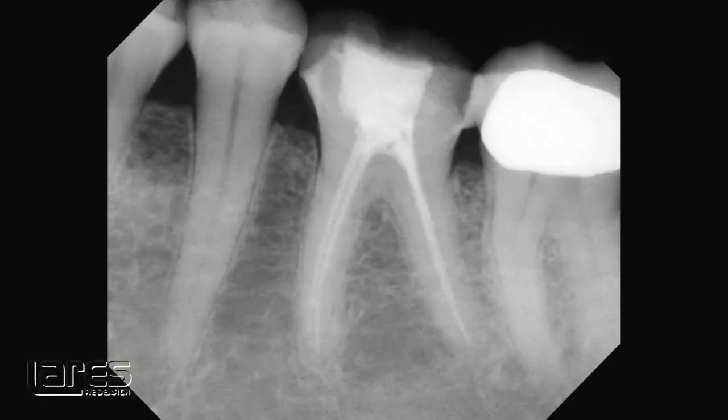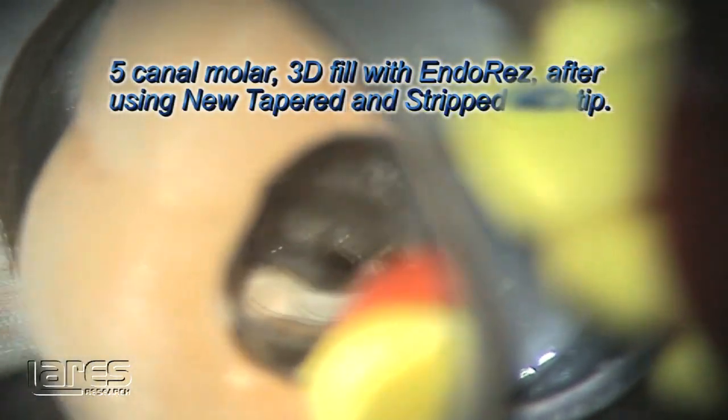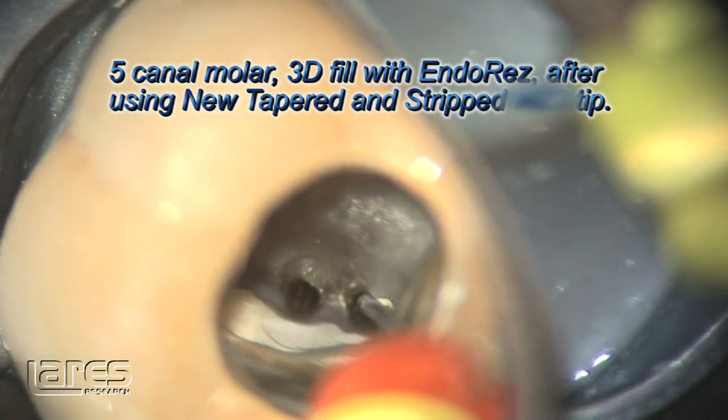Here's a five-canal lower molar — there are three mesial canals here. This is a lower first molar, not a wisdom tooth. I'm filling one canal and three-dimensionally obturating all the canals at the same time.